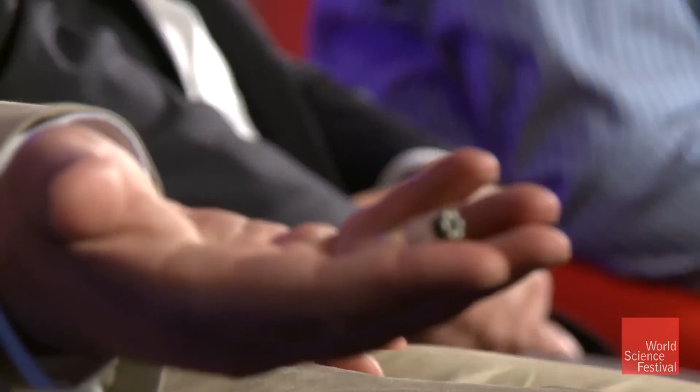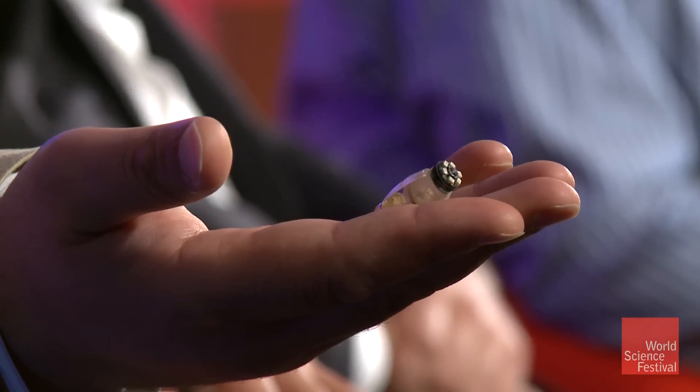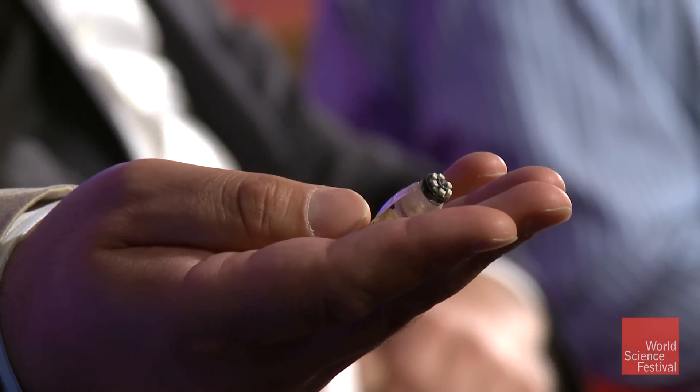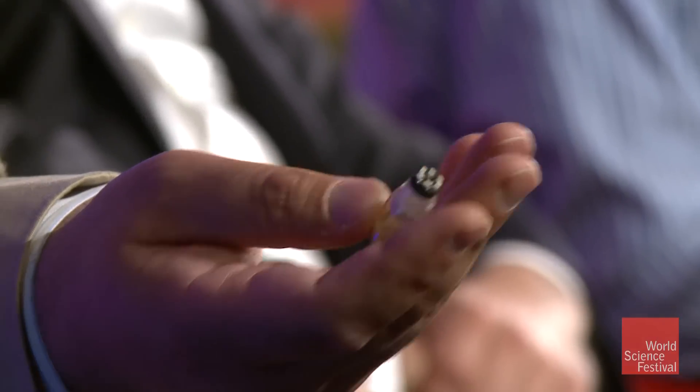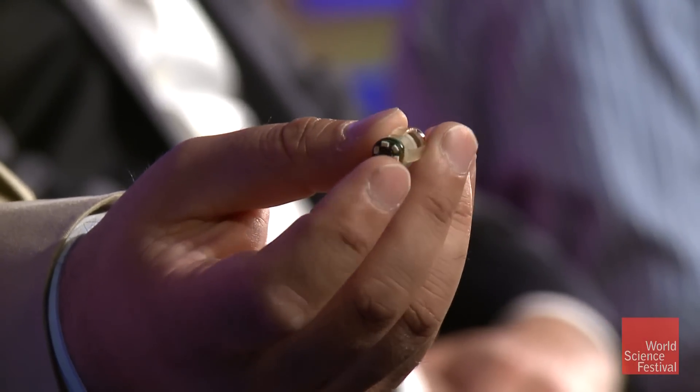We are starting from a little bit bigger size as an example. This is a swallowable capsule robot which has a camera on board and wireless communication. There's a very tiny camera — the black parts of this — and you can see LED lights. The camera is at the end here.